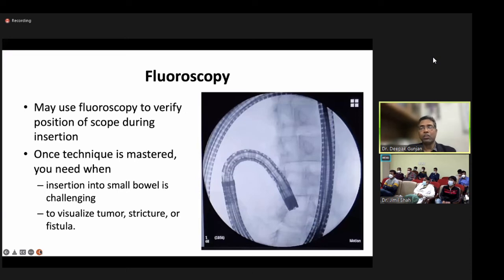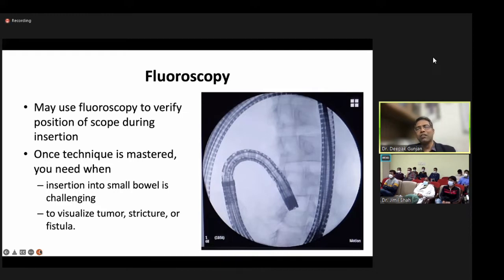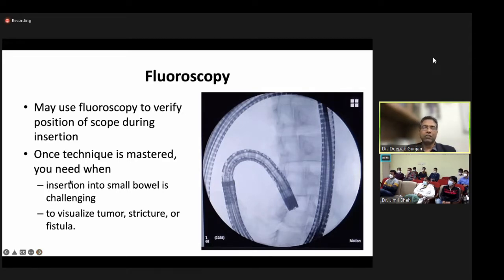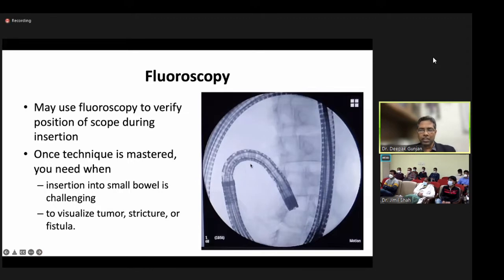Fluoroscopy is required during the learning curve and useful even for experienced endoscopists when stuck. It helps you know how deep you have reached and is required when facing difficulty advancing or when you need to visualize the length of strictures or fistulas. When you master the technique, you require only a few fluoroscopies. In this fluoroscopic image, you can see we were not going beyond the ileocecal junction, so we used fluoroscopy to find out where we were stuck.